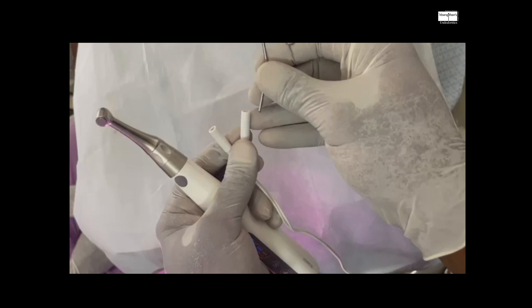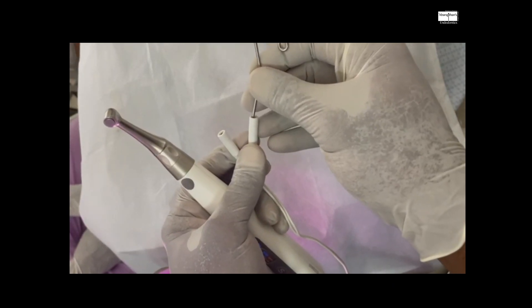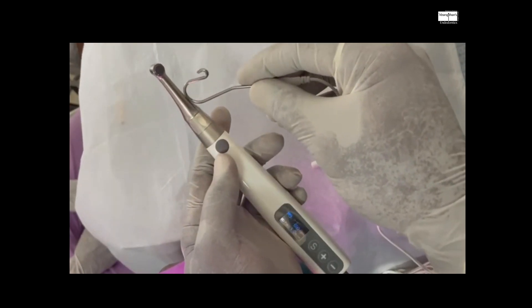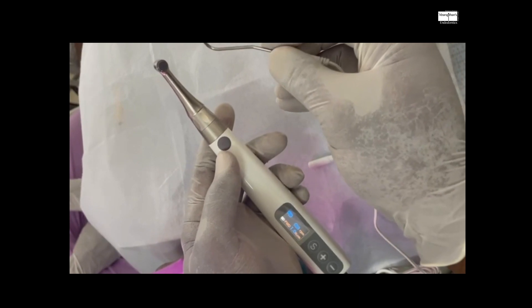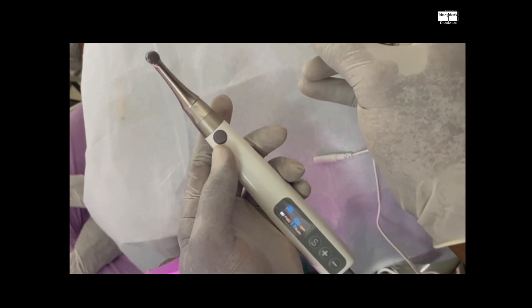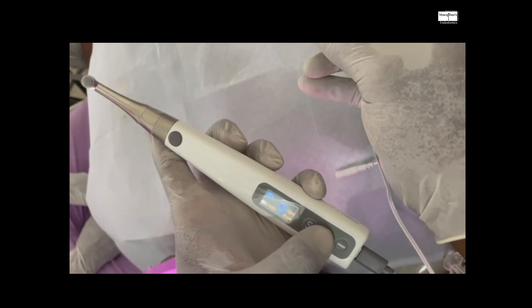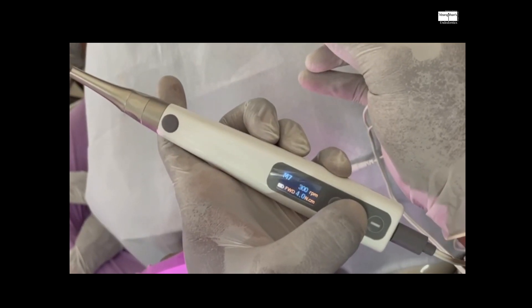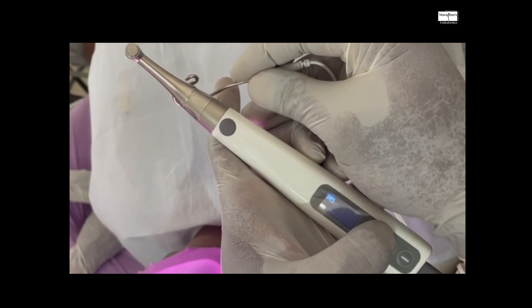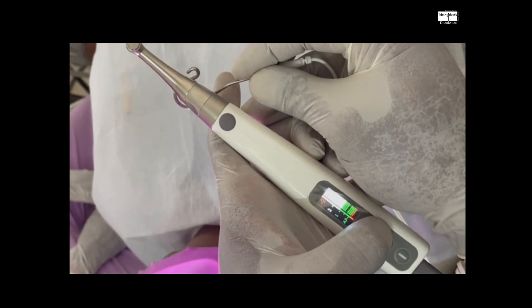Now for the integrated endometric program — the most exciting function — which applies to all rotary programs M0 to M9: you do not need the file holder at all. All you need is the lip clip; the other slot is left empty. The lip clip acts as one electrode and the head of the handpiece acts as the other electrode. When you place the rotary file in the handpiece head, it conducts and completes the circuit. This integrated function works automatically across all programs M0 to M9.